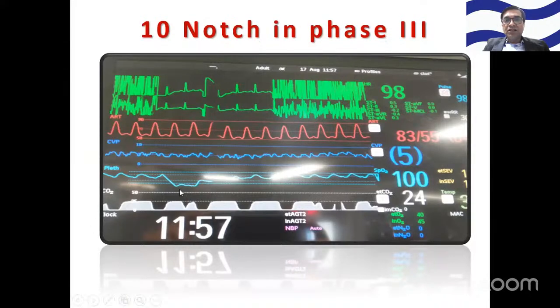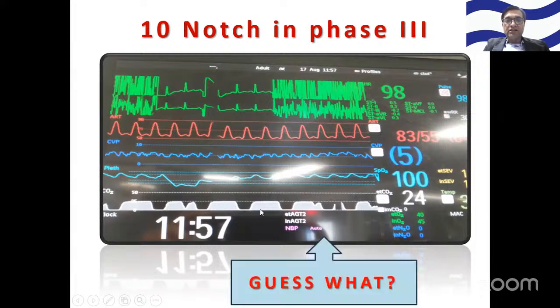So this is a notch in phase three. Okay, you can see the notch in phase three here, right? Are you able to appreciate it? Tell me what could be the diagnosis.